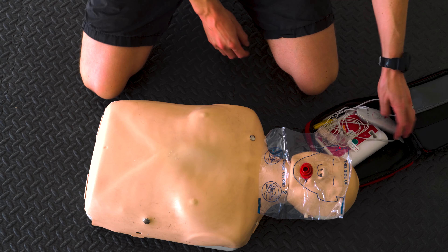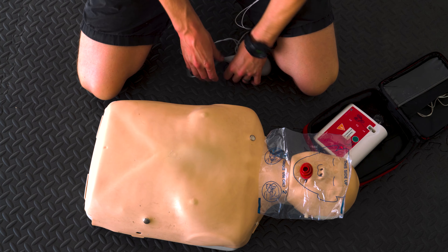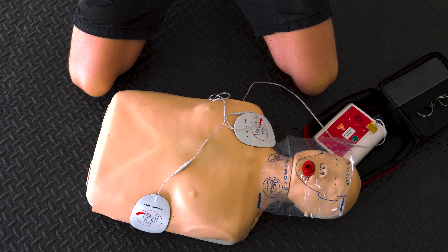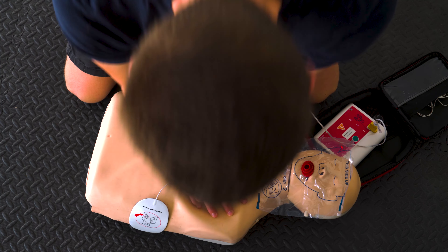Once the AED arrives, you follow three simple steps. First, turn the power on and follow the prompts or commands of the AED. Then attach the pads to the patient. Once the pads are attached, plug the AED in — though some AEDs come already plugged in, so there's no need for that third step. The AED will tell you to stop compressions while it analyzes the heart rhythm. If the heart is in a shockable rhythm, wait for it to charge, then clear the patient, hit the shock button, and start CPR immediately, beginning with compressions. And that is the basis of CPR.